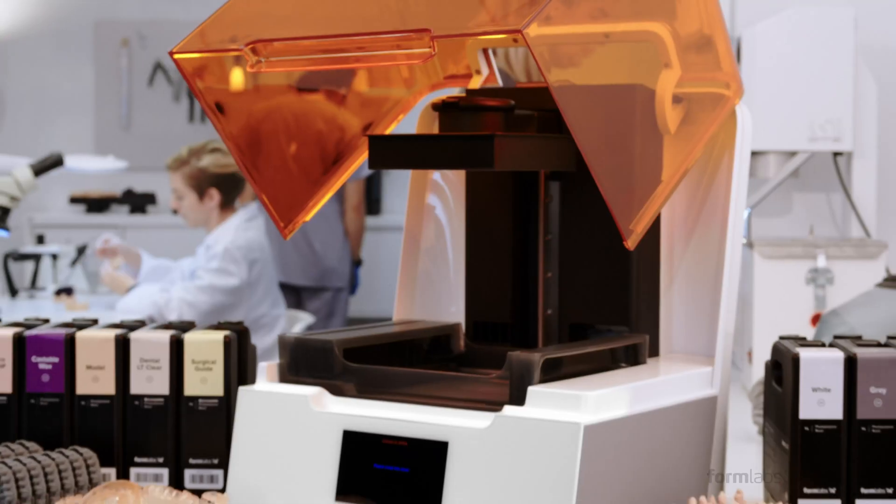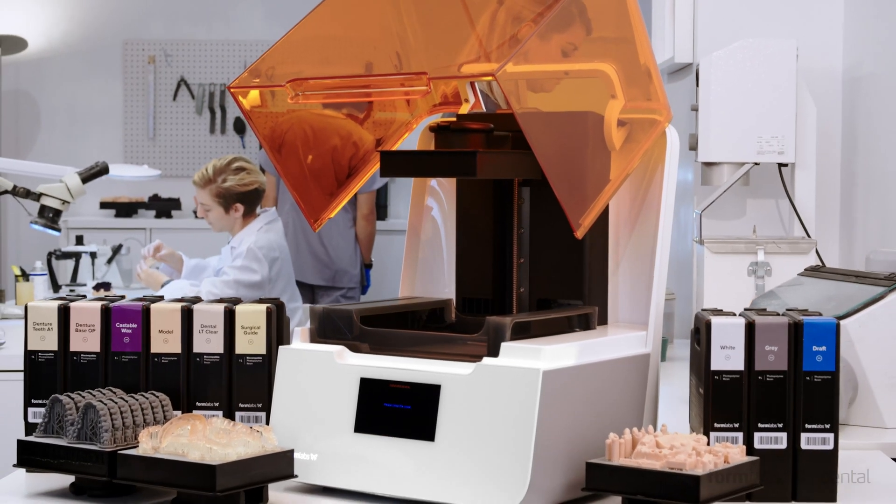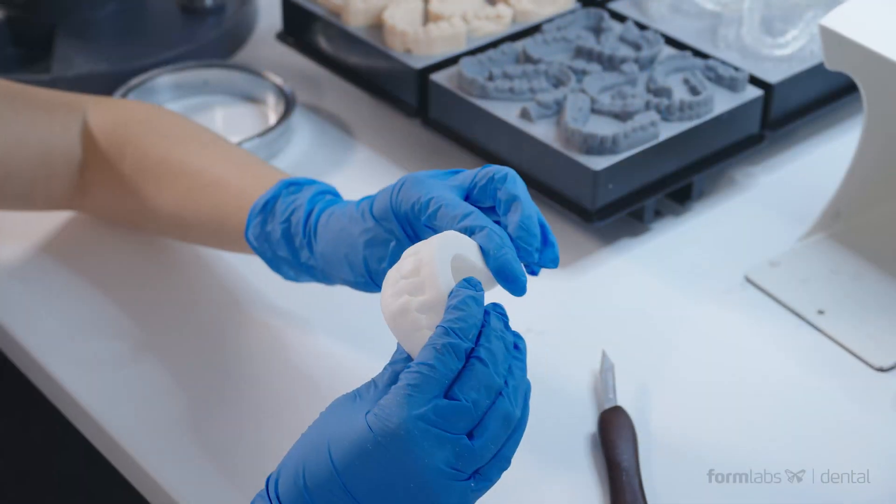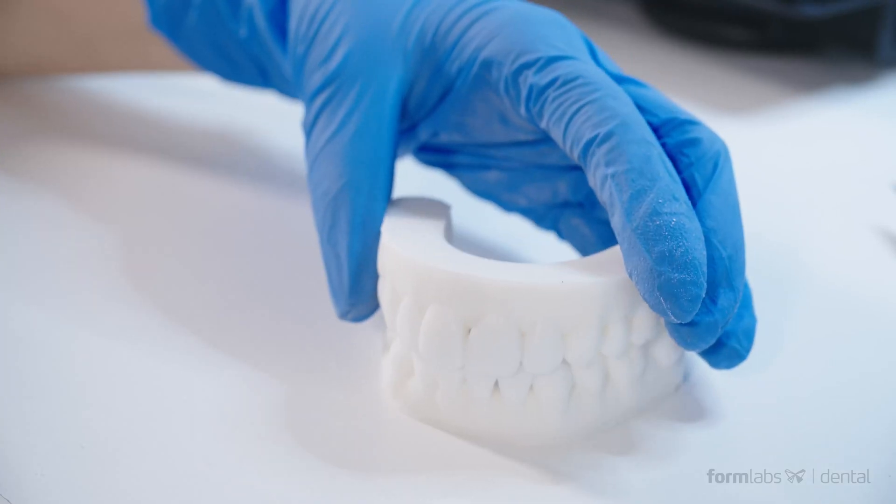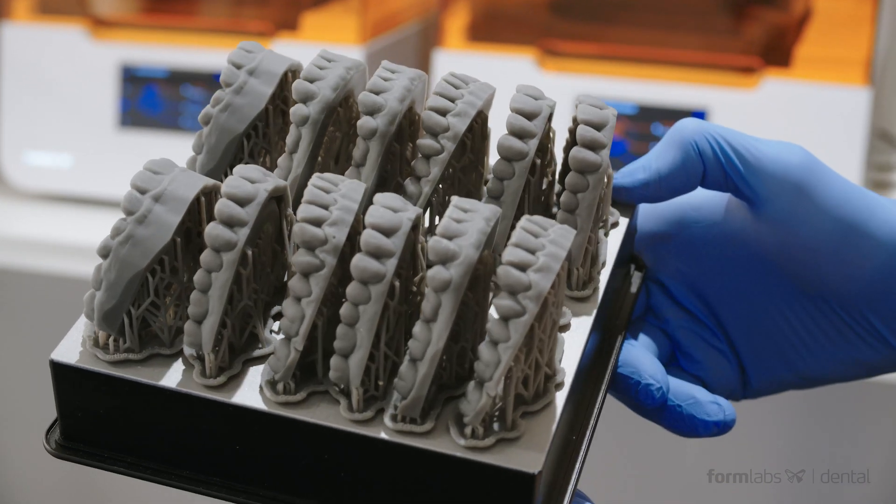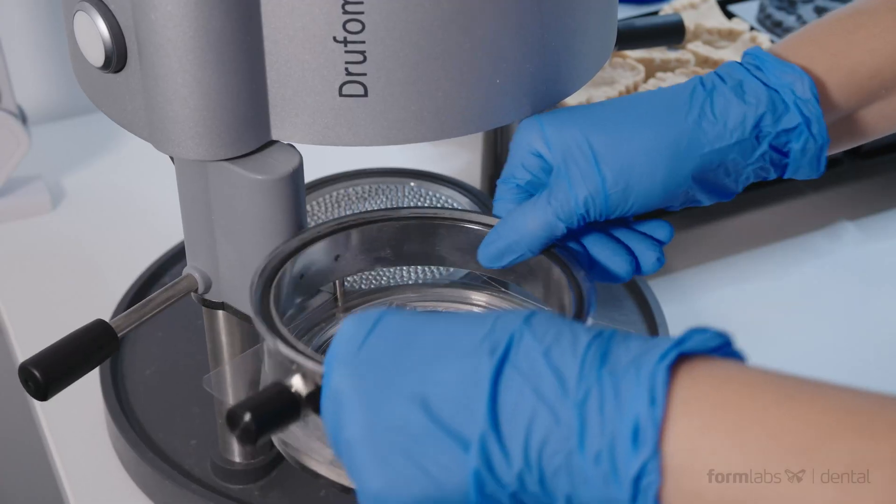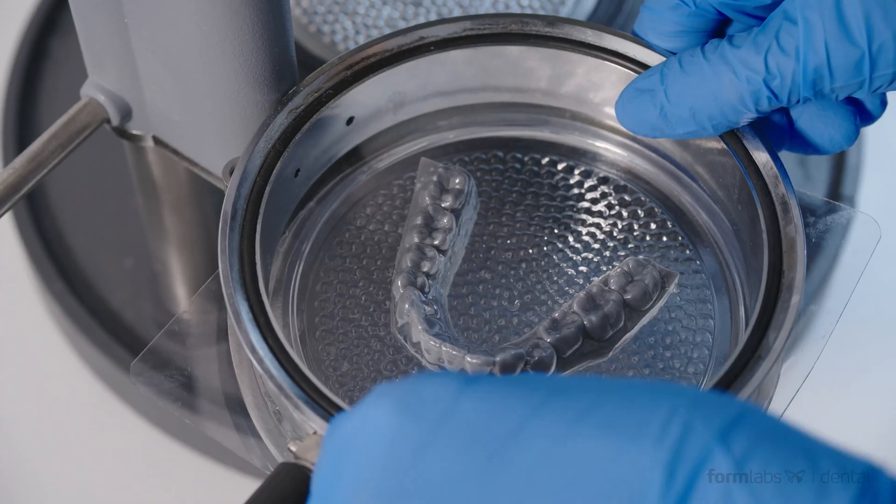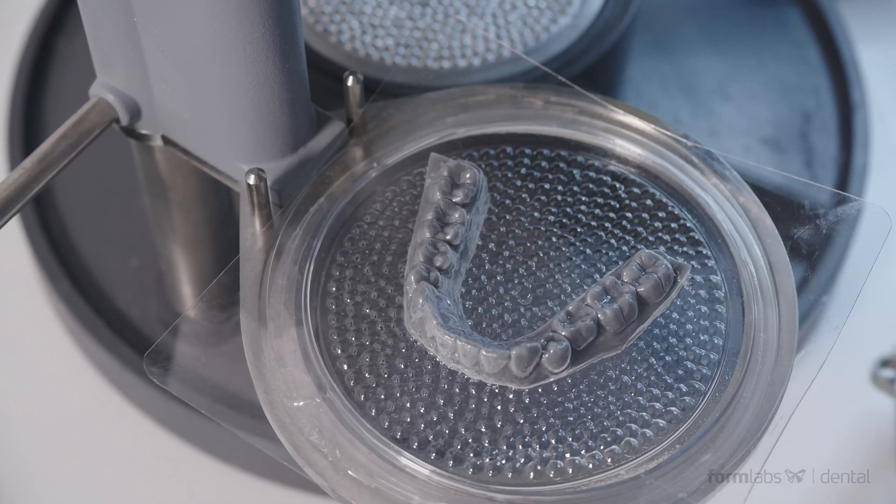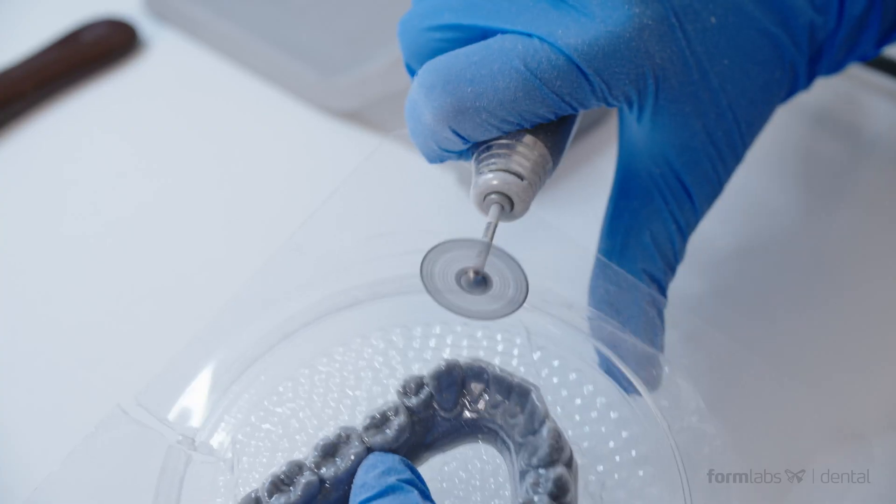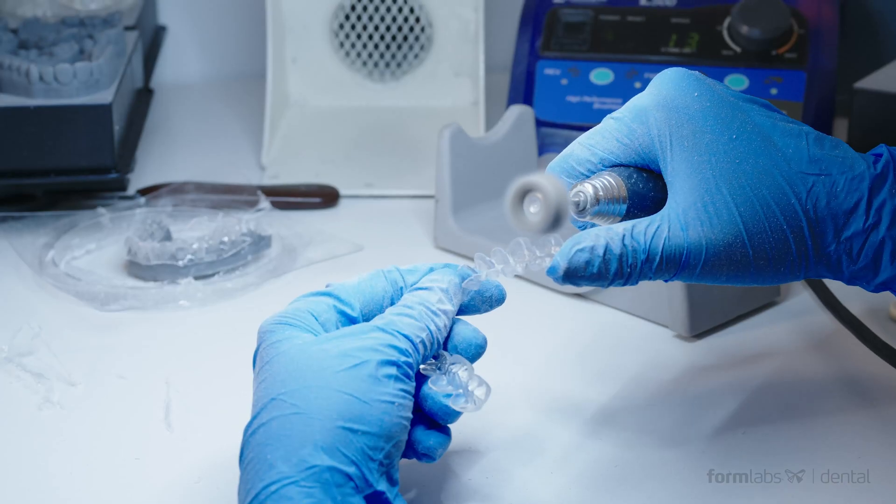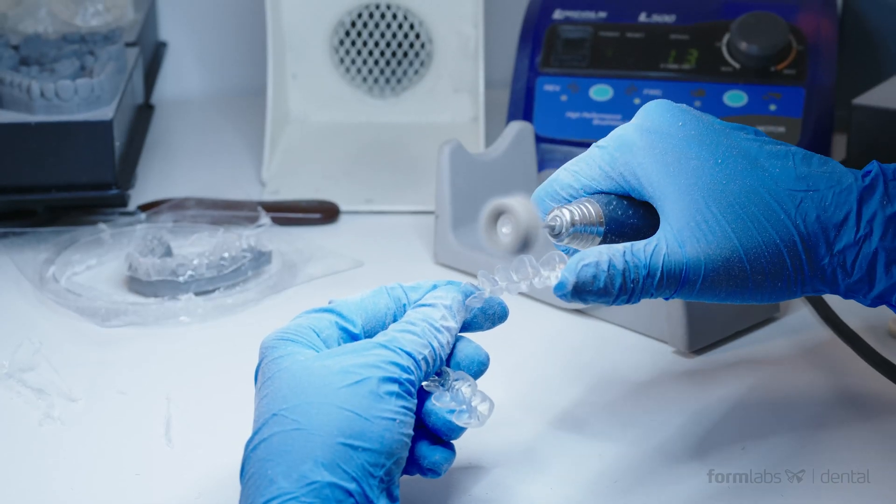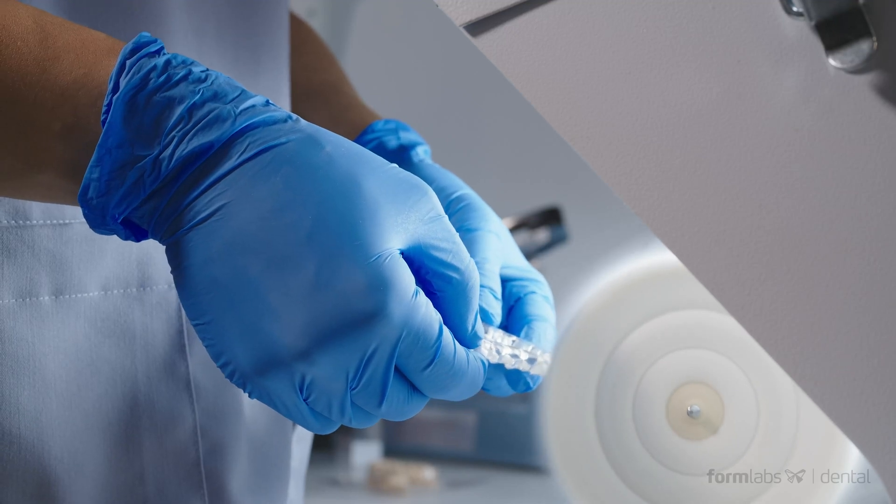Everything about the Form 3B was designed to help anyone achieve better results with less effort. And more parts per job means less time, less effort, and better margins. Orthodontic practices can see an average of 55% less labor and costs compared to competitive 3D printers.